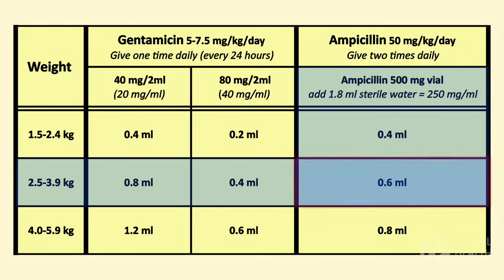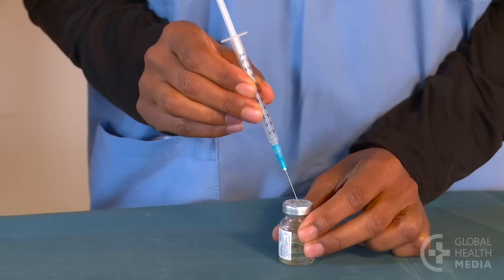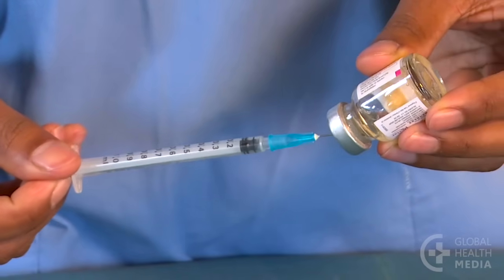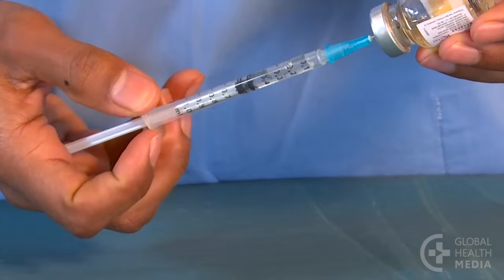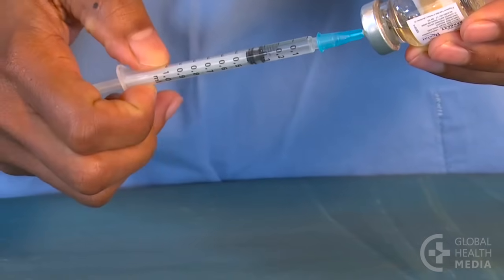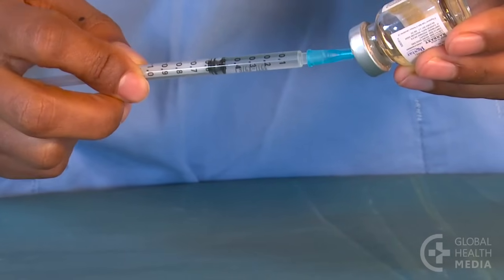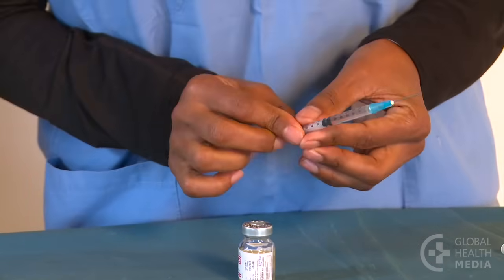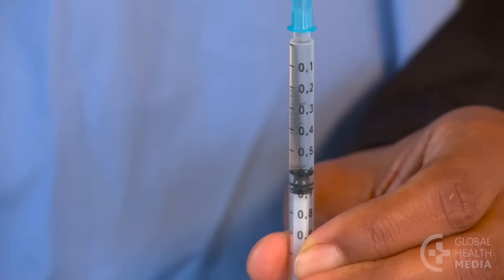The baby will need 0.6 milliliters of ampicillin. Draw 0.6 milliliters of air into the syringe, then inject it into the vial. Turn it upside down and, keeping the needle in the fluid, draw up your dose. Notice the bubbles being returned back to the vial before removing the syringe. Tap the syringe to clear the remaining bubbles and gently push the plunger to remove the air. There's your dose of 0.6 milliliters.